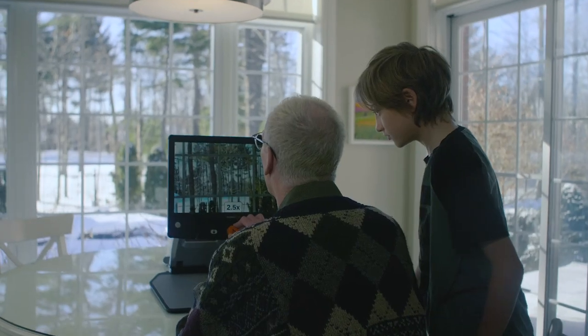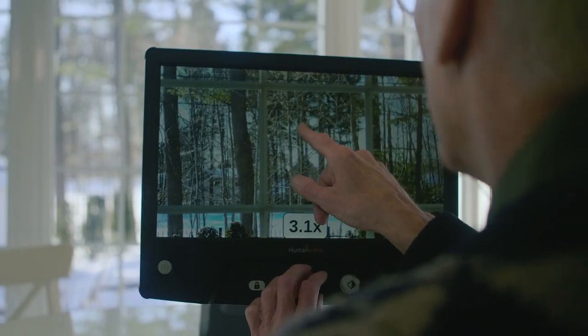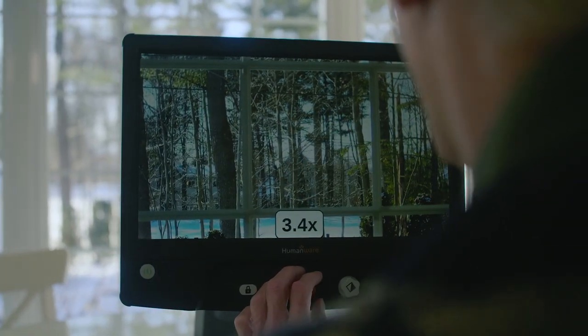The Reveal 16 has got it all! Enjoy the amazing landscape around you thanks to the distance viewing camera.